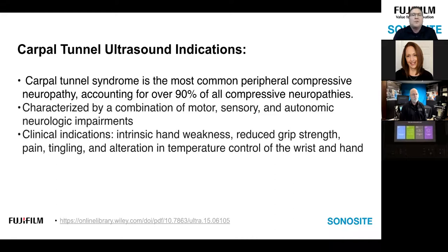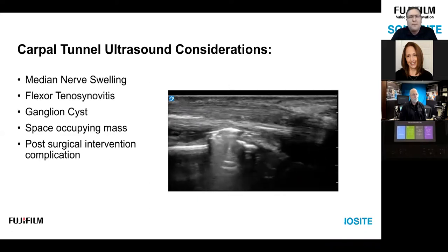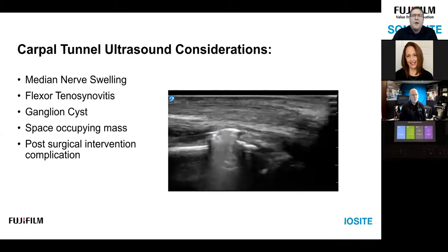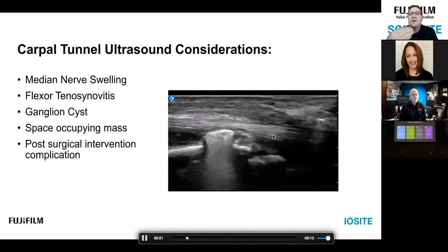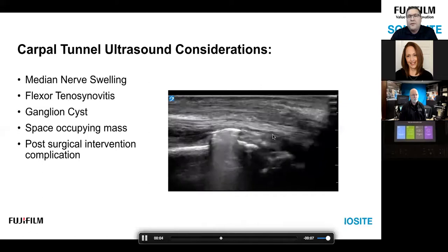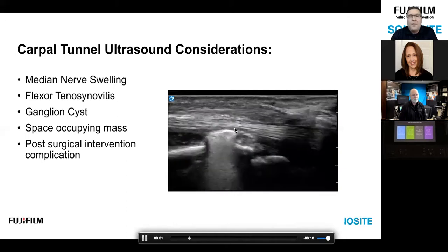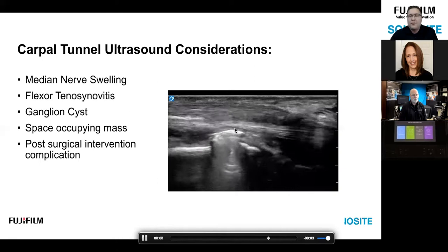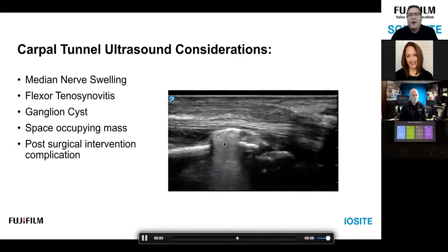Other things to look for besides swelling: flexor tenosynovitis, ganglion cysts, space-occupying masses, and post-surgical intervention complications, like this distal radial fixation creating a big metallic artifact shadow over the distal radius. Look at the flexor tendons in that region — if the patient is exhibiting median nerve entrapment symptoms, look at the surrounding flexor tendons to see what may be causing them to swell and press against the median nerve. Ultrasound is really nice here because post-surgical interventions won't cast artifact into areas of interest the way MRI would.